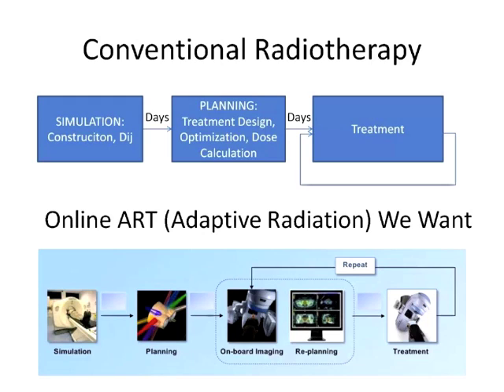And this slide will talk about the GPU side that we developed, and was found out to be quite successful for the condition of a hospital situation. In the hospital, the cluster is a little bit over budget, or system maintenance is not much a focus for them. We thought about using some on-demand type of resource scheduling with other supercomputer centers, but latencies and some reliability is an important issue.